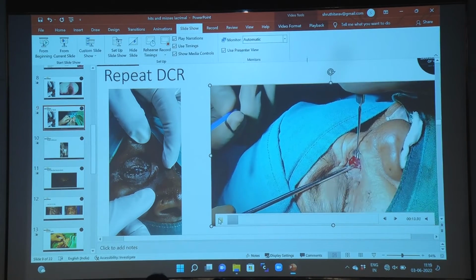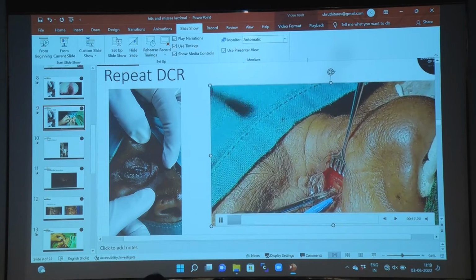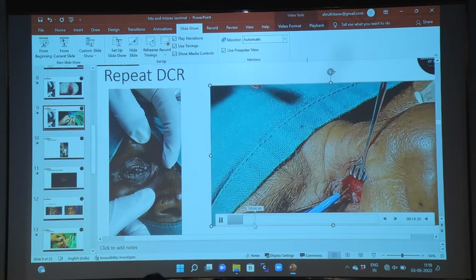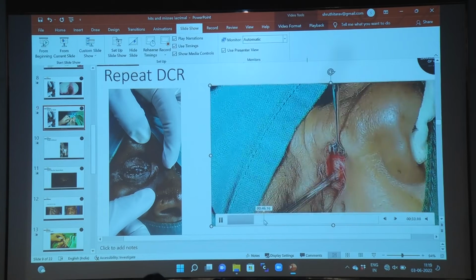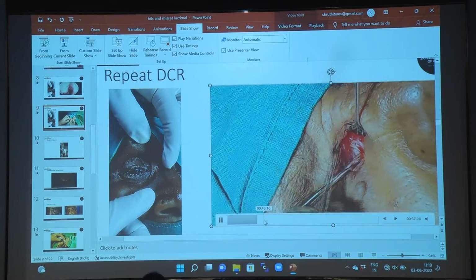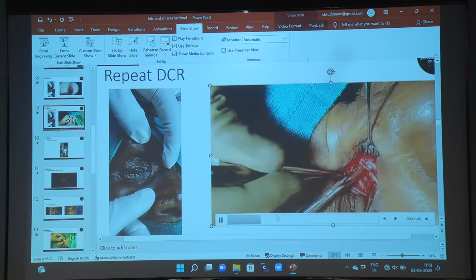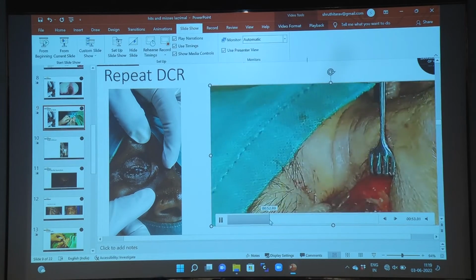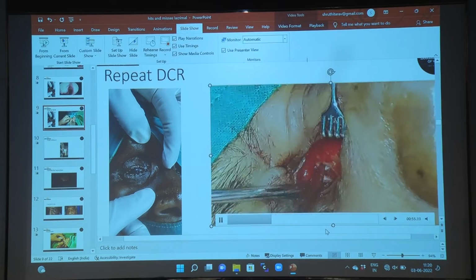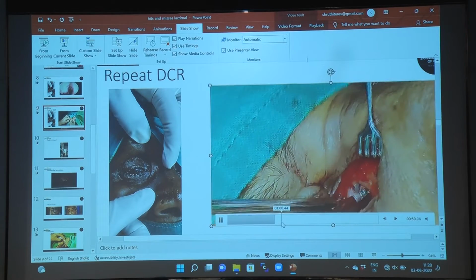And this is one place where probably I would use a lot of cautery, adequate cautery I mean. And you have to go in anterior to the already made old ostium, and extend the ostium along. So it's not actually impossible to make a good DCR in such scenarios.